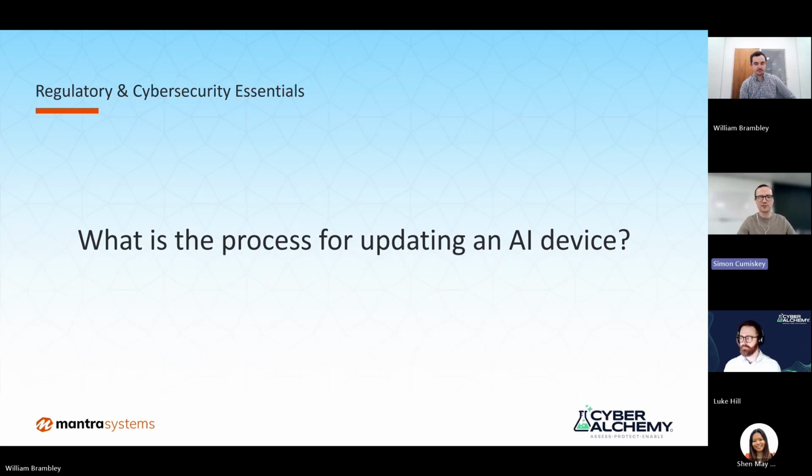But if you've got a certified CE marked medical device and you're looking to add some features, speaking with your notified body early can be really helpful, because you can get an idea of whether, if I make this change, they're going to want to review the documents that I've produced before I can deploy that change. Or they're okay with me making this change and it being reviewed at my next surveillance audit, which is always a better outcome in terms of being able to push changes quicker and iterate faster.